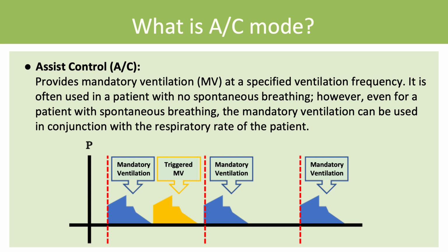AC mode assists all spontaneous patient breaths sensed by the ventilator even if the frequency of the spontaneous breaths exceeds the preset frequency of mechanical breaths.